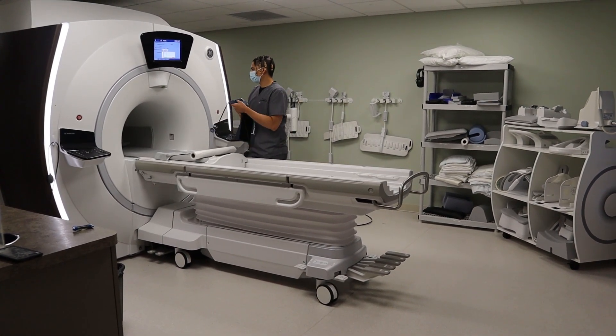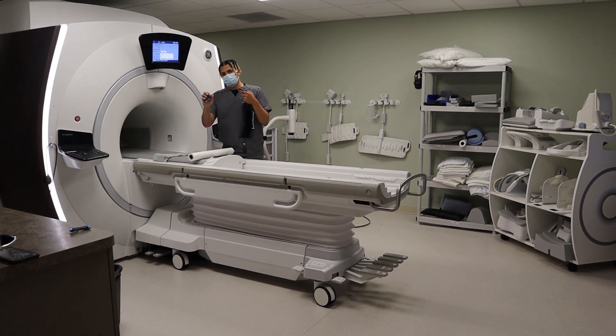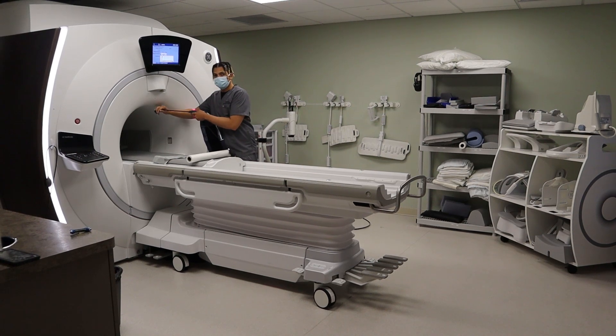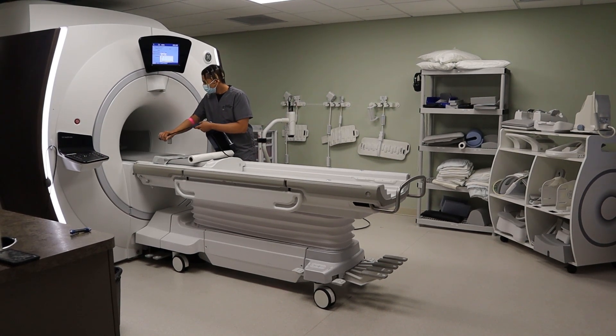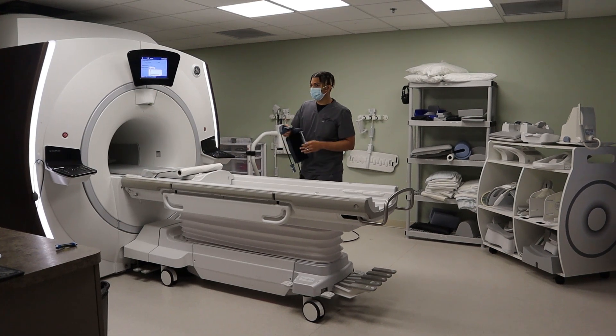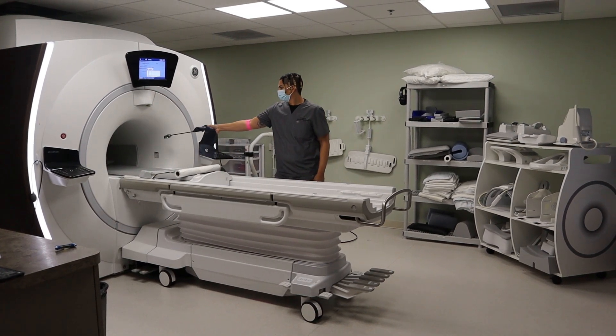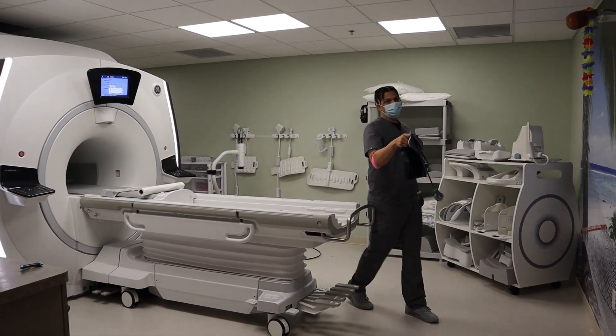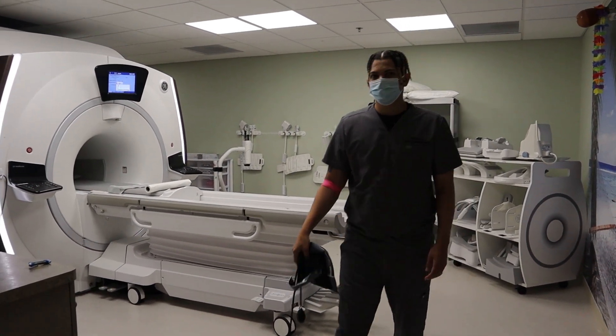Someone's head is right here. The heavier the metal object is, the faster it's gonna pull, and it can strike somebody. That's why you don't bring metal into an MRI.